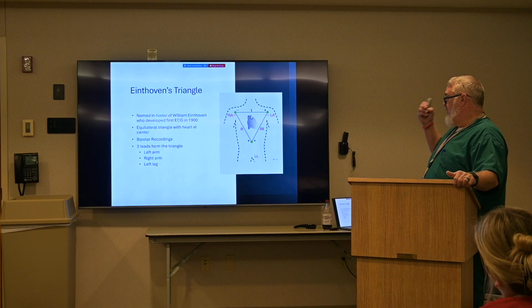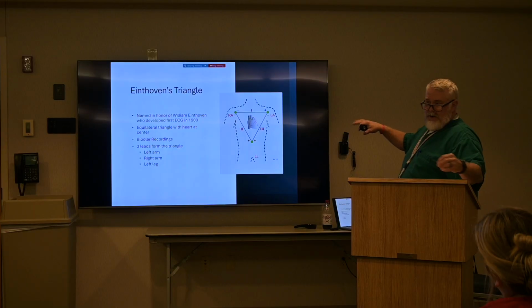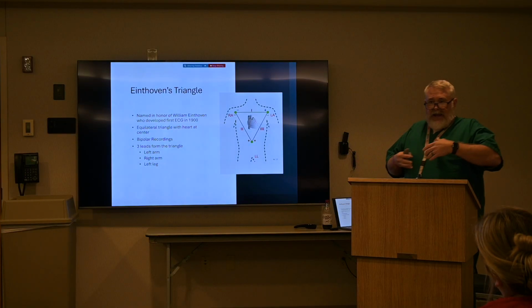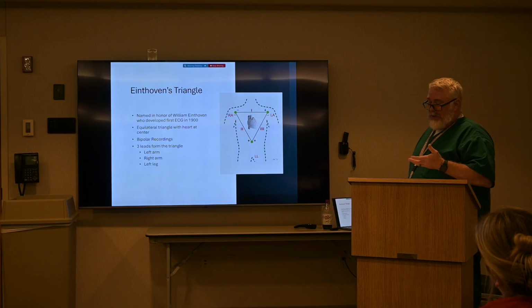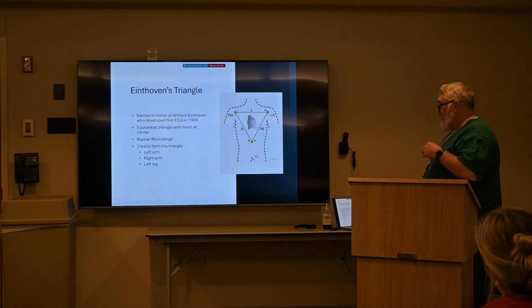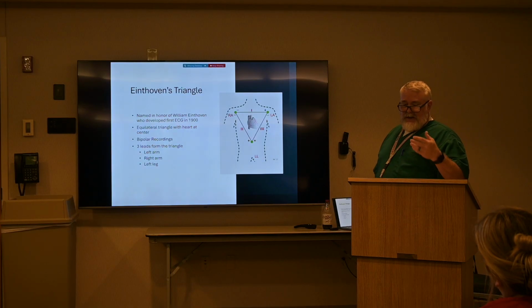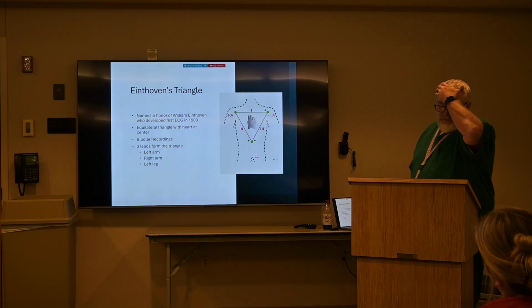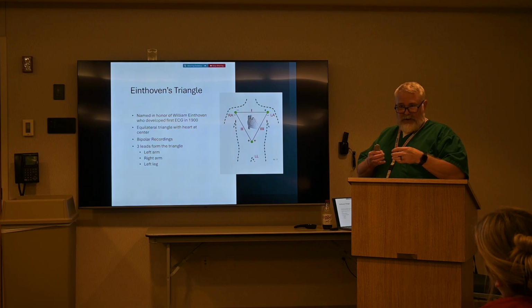So where did the ECG start out? We're not going to get deep into this, but the ECG actually came into fruition a long time ago. Back in 1900, William Einthoven developed the first ECG monitoring system. And in 1901, he developed the string galvanometer, and this allowed for a weak recording of electrical pulses in the body.